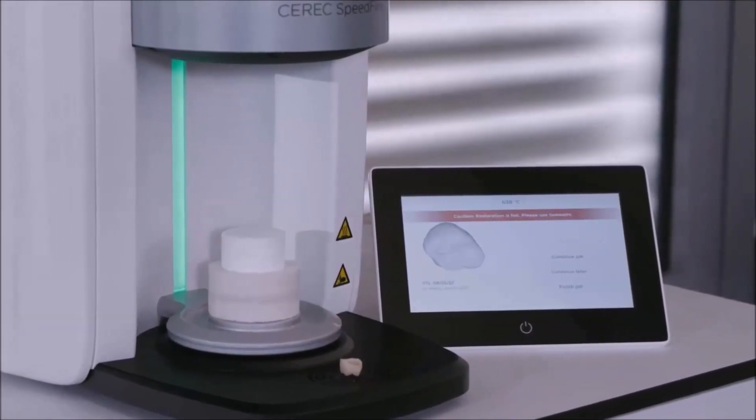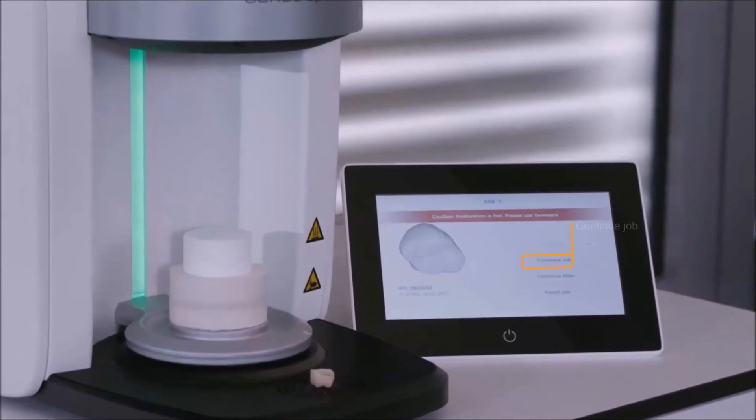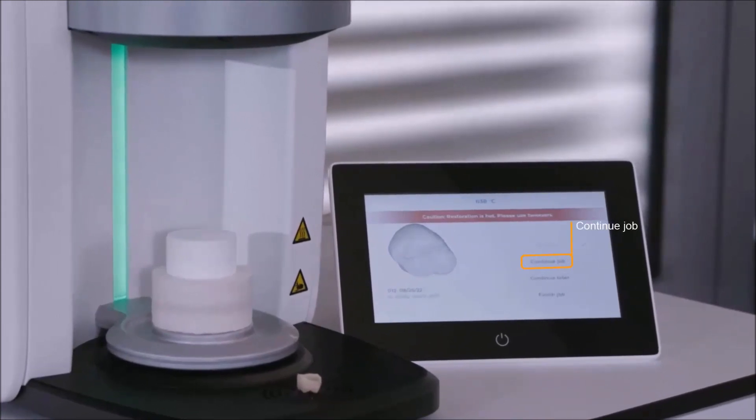There are several ways to proceed from here. First case: continue the job — we can perform a glaze firing after sintering. Second case: continue later — a glaze job for CEREC MTL Zirconia is added to the job list, which we can initiate at any time. Third case: finish the job — the order is completed without glaze firing. In our case, we have selected Continue Later, and will now first look at the necessary utensils for glaze firing CEREC MTL Zirconia.